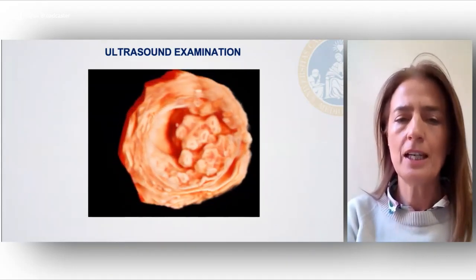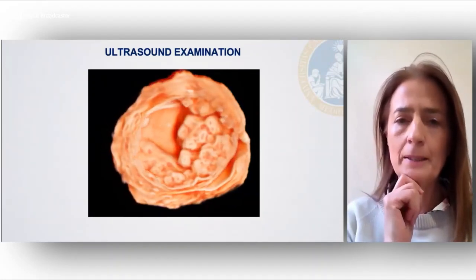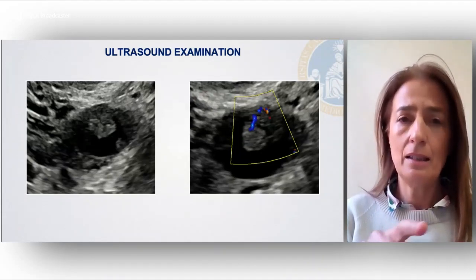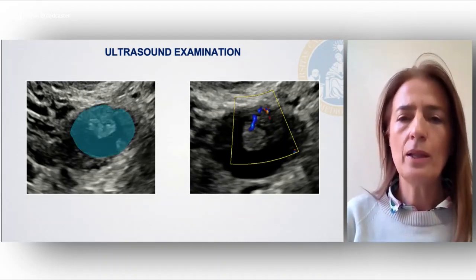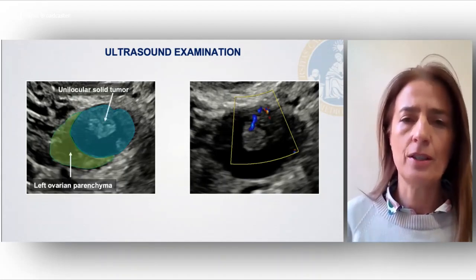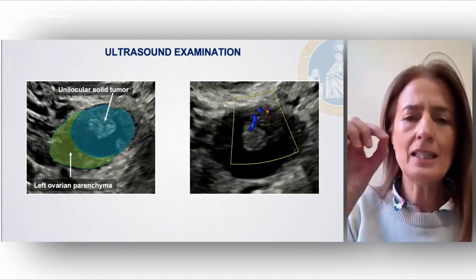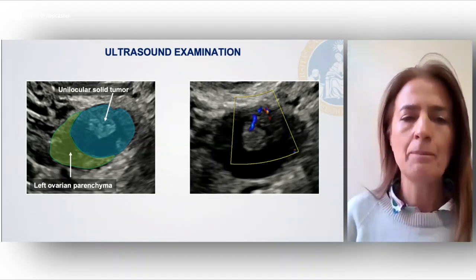Perhaps you observed normal ovarian parenchyma, a percentage of normal ovarian parenchyma, and this was on the left side. On the contralateral side, we can detect this is the ovary. Within the ovary, again, a unilocular solid lesion with one papillary projection. And pay attention to the vascularization, both in the previous one and also in this one. There is no rich vascularization, but we can see this vessel penetrating in a perpendicular, quite regular manner.